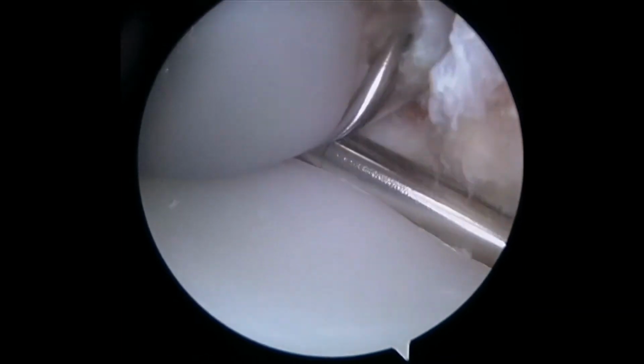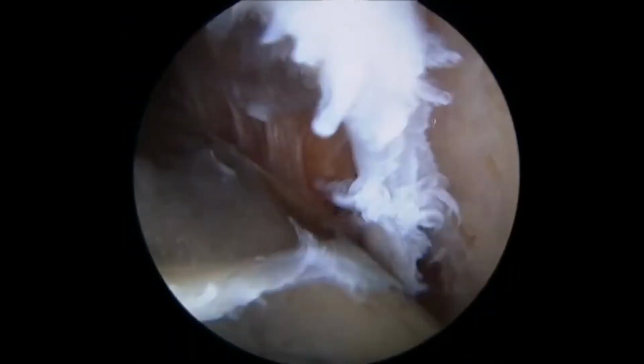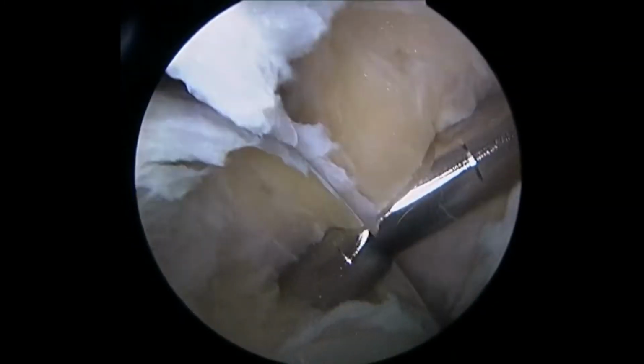So there's some tissue that can impinge or pinch between the metal and the plastic. Again, in this case, it wasn't really where the pain was coming from, because it was when she was bending her kneecap. And so I'll show you, we'll get to that in a sec here, where you'll see the tissue underneath the kneecap was getting pinched. So this is what we would call the medial gutter, the medial side. Now we're coming into where the kneecap is. So to the top is going to be the patella or the kneecap.